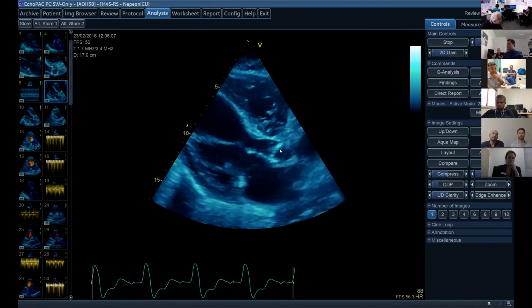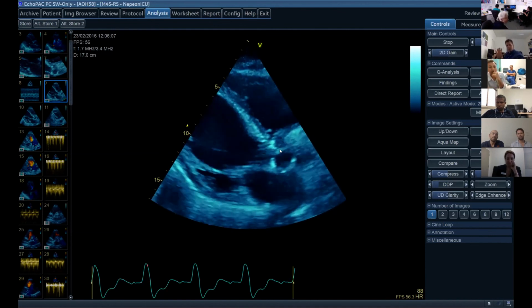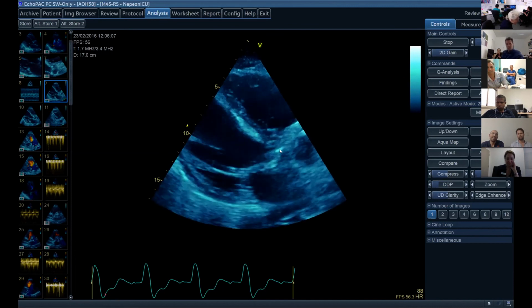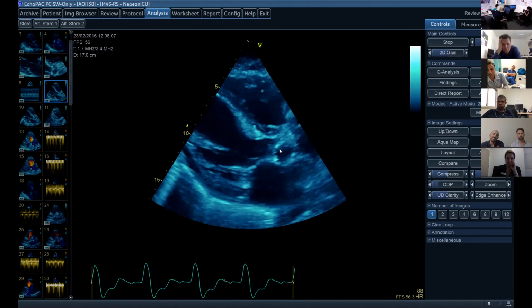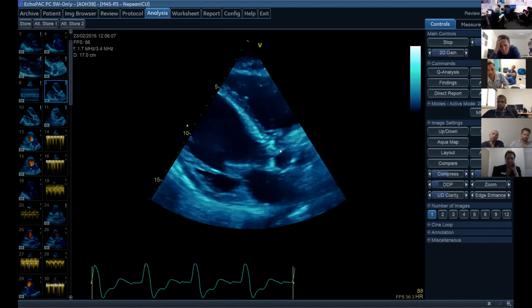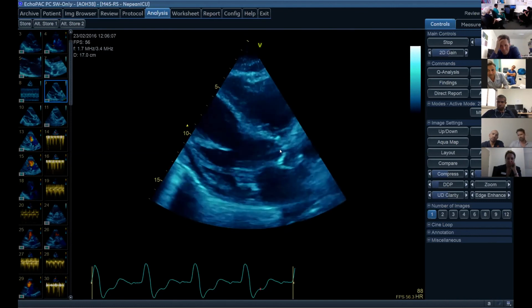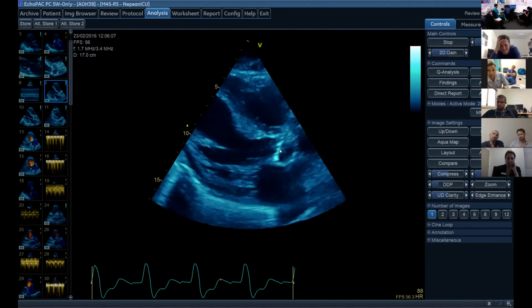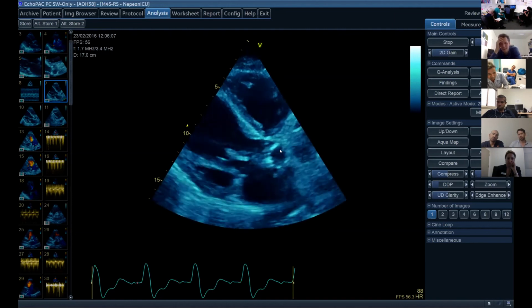Okay, are there any questions or comments? Nice way to end, talking about the controversies about that, I think. Sam, I had a question. Sure. When we measured the LVOT at the root of the annulus, the root of the insertion of the valves, I have read somewhere, and some people have also mentioned, that we can actually do a measurement around 5 millimeters.